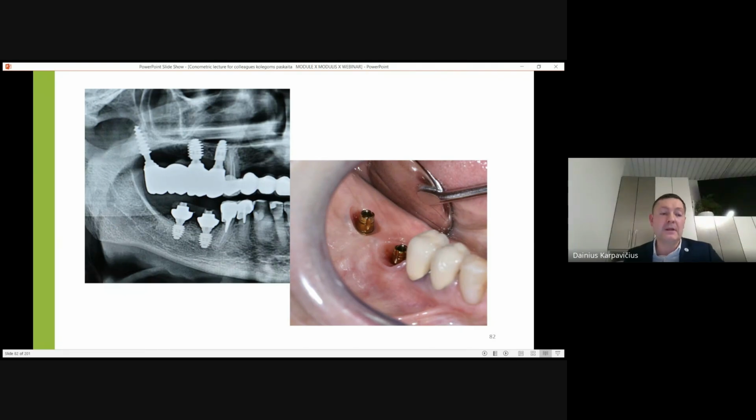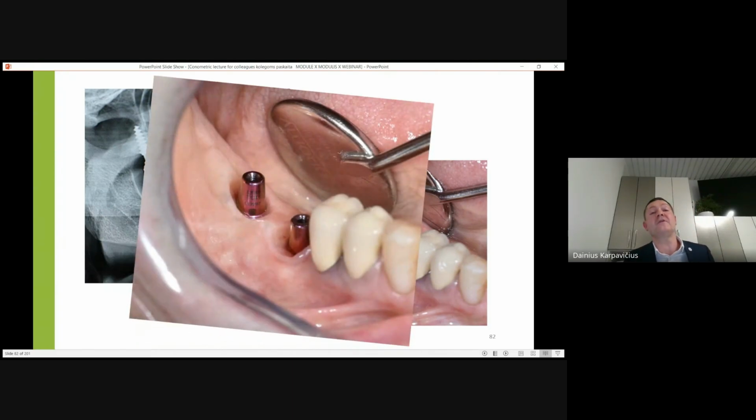For example, if today you have chosen an abutment of 2 millimeters, after 10 or 15 years you can switch to an abutment of 1.5 millimeters, or even to a regular T-base, the lowest. So this reserve is very important regarding the aging of our patients.